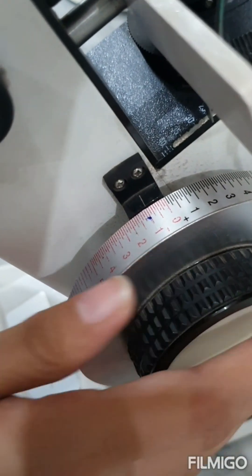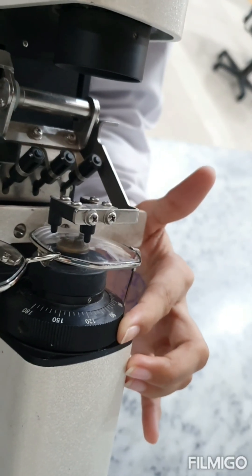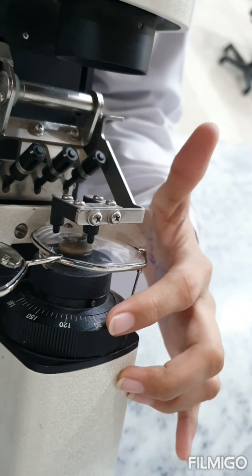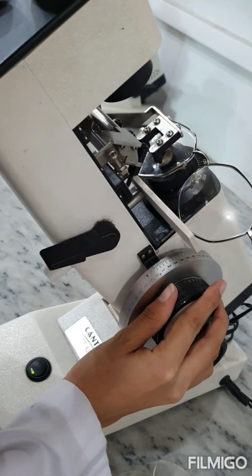Now rotate the axis wheel such that the central dotted lines lie in a parallel orientation to the bright meridian. The next step is to rotate the power drum where the bright meridian becomes more sharp and now note the power obtained.